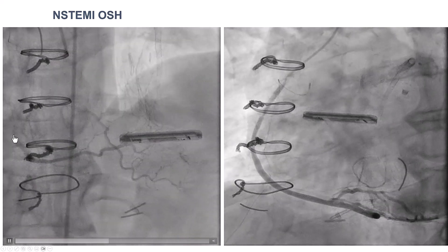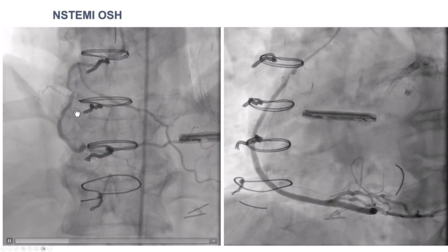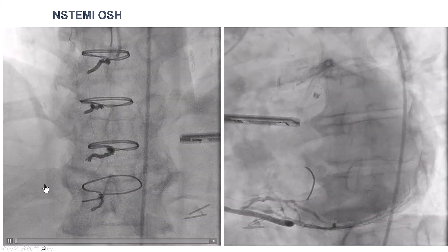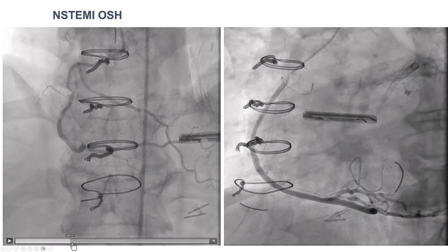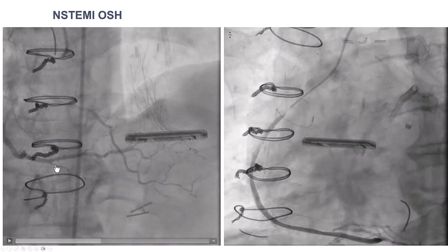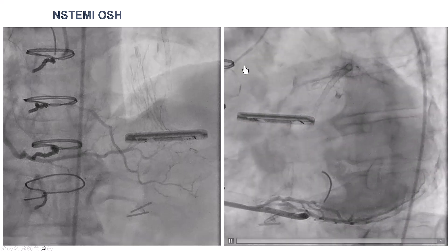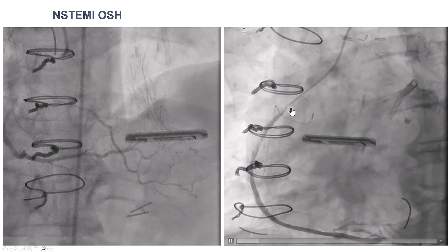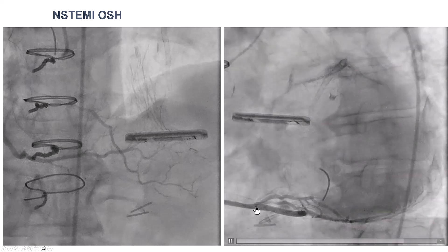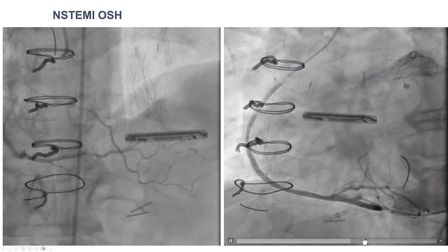The right coronary artery is diffusely diseased, and although the anatomy is a little challenging because of significant tortuosity, we can start seeing that there may be an area of nub — a little tapered entry into the CTO — right after the takeoff of this acute marginal branch. This is injection through the saphenous vein graft that has recurrent in-stent restenosis in the proximal segment and goes to the PDA, and we can see that the distal vessel reconstitutes at the bifurcation of the PDA with the right posterior lateral.